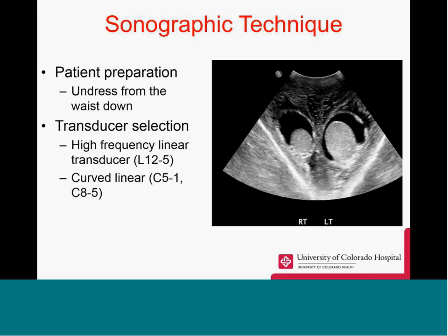The transducer selection will vary. Typically, you're going to use a high-frequency linear transducer. You can see in this scrotum here, we had to use a curved linear transducer because of massive scrotal edema. The lower frequency was needed in order to penetrate.